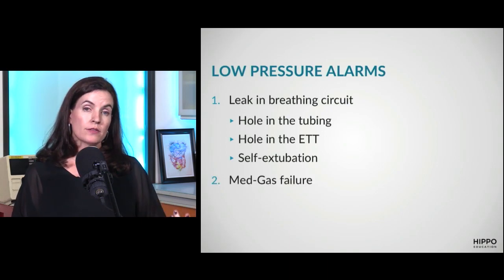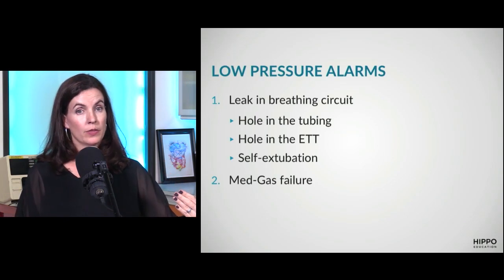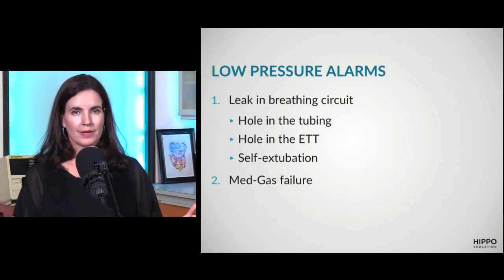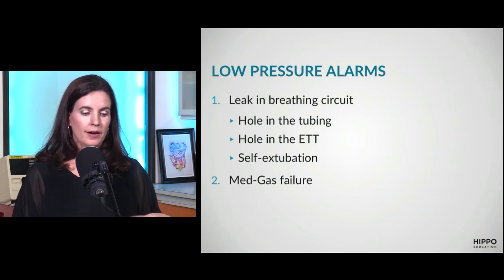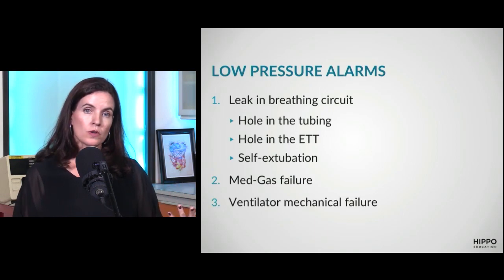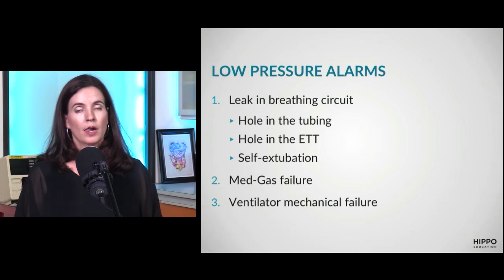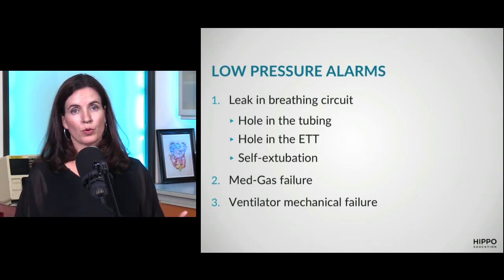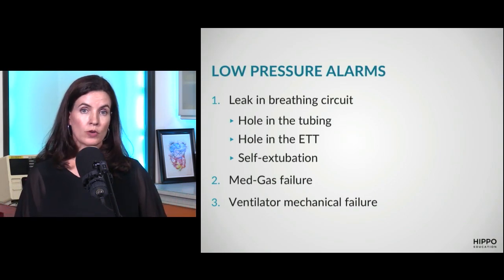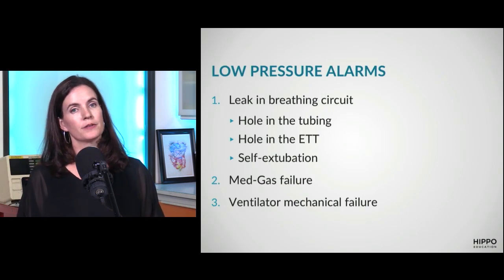Now, in rare circumstances, you can have med gas failure. What I mean by this is, in your hospital, the medical gas in the walls can stop flowing. You usually know this because it's a form of internal disaster, and often they'll call a code overhead notifying people that this has happened. So this is usually not a surprise. You can also have a total failure of your vent, where again, you would just take the patient off and bag. But a low pressure alarm is a leak until proven otherwise. So if you're seeing that flashing at the bedside, you can examine the tubing and the endotracheal tube to make sure there isn't a hole, or in fact, to find the hole and then plug it.